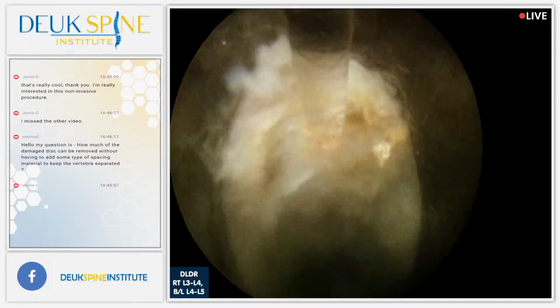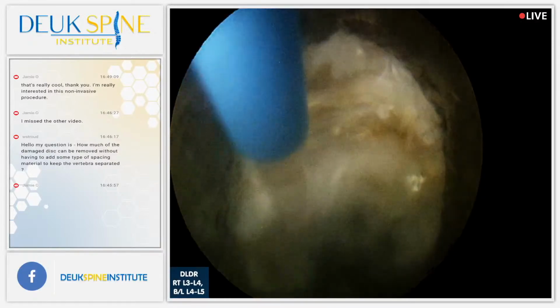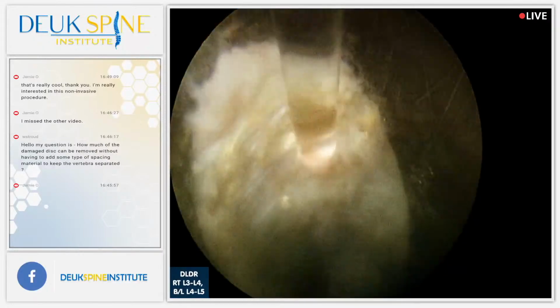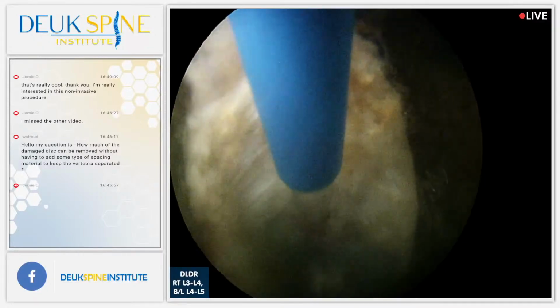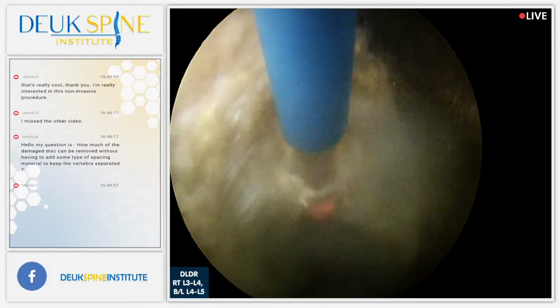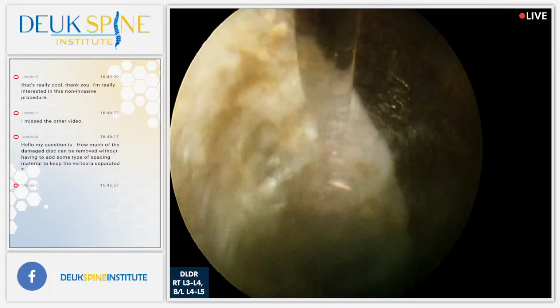Yeah, you're going to change the irrigation? All right, well, Henry's going to write it down for you. Jamie, the procedure is called the Deuk laser disc repair.